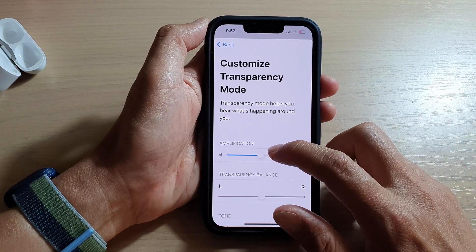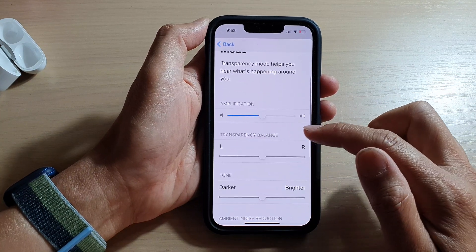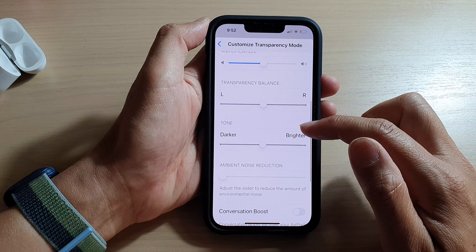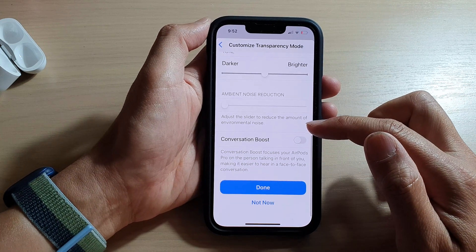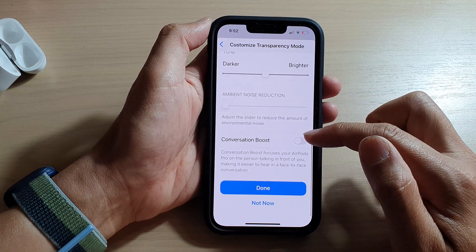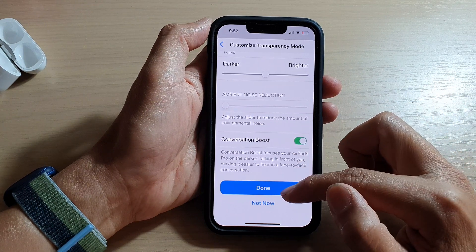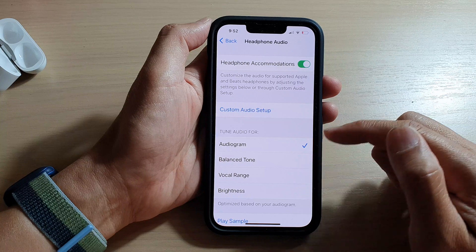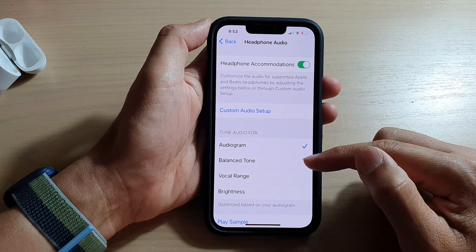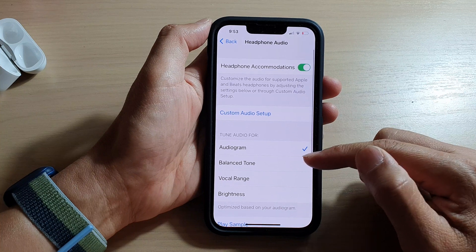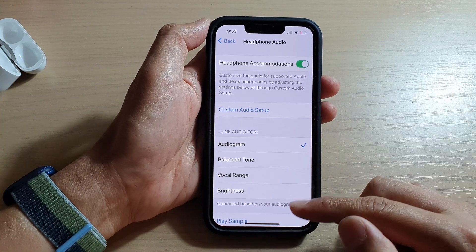In here you can see the amplifications, transparency balance, tone, ambient noise reduction, and conversation boost. I'm just going to tap Done now. Here we've got Tuned for Audiogram — we've just added an extra option in this headphone audio.